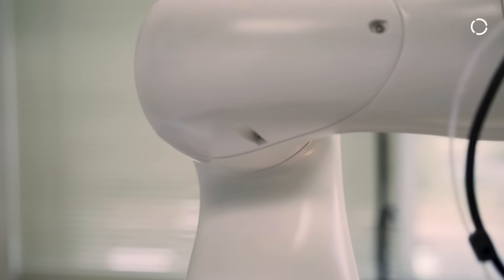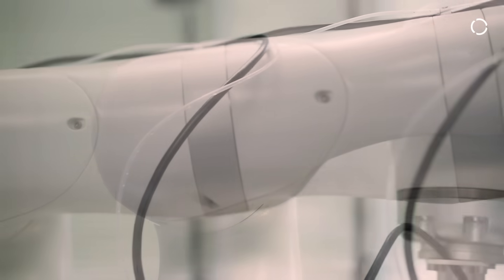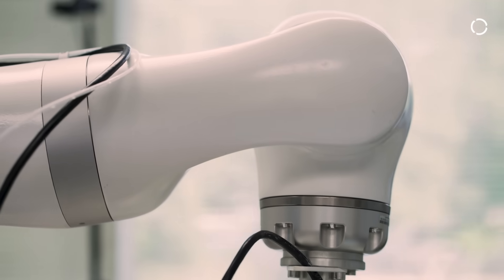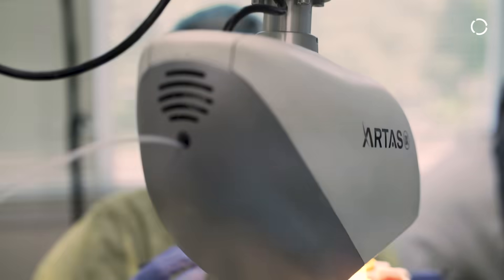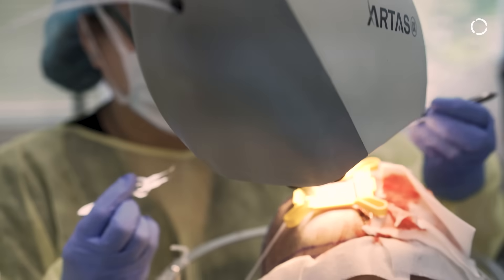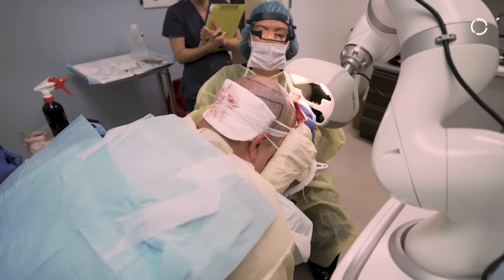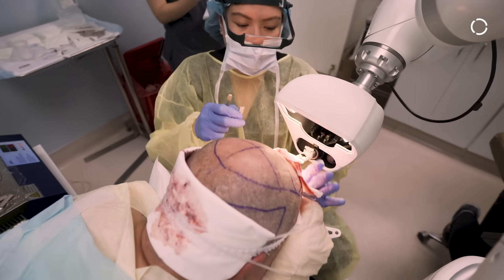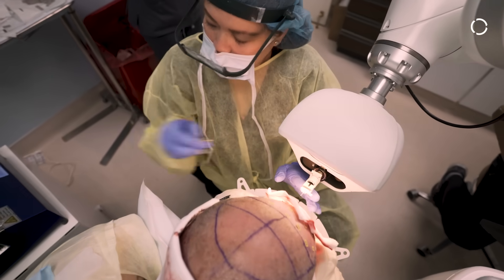The fact that you can monitor every single joint and know exactly how much force and how much torque that joint is producing, that's a big advantage when it comes to safety, especially when you're working on surgical stuff and the patient. You're trying to create that symbiosis that helps a lot.